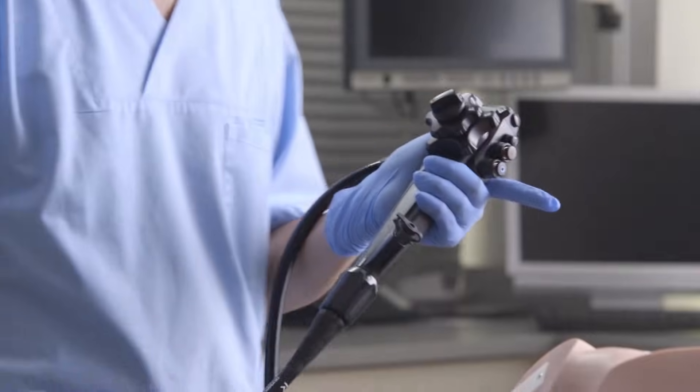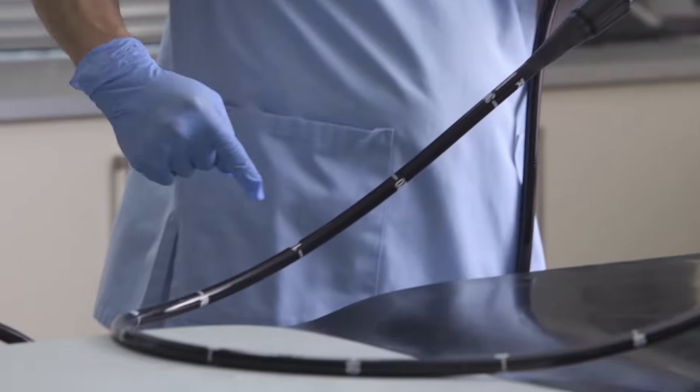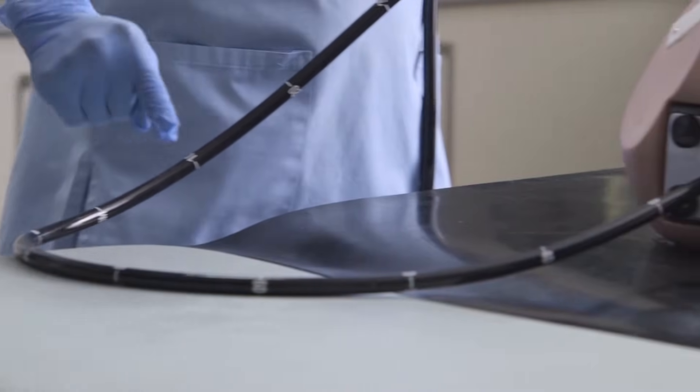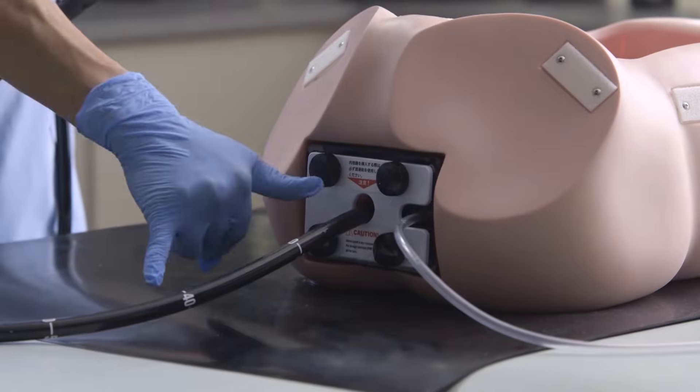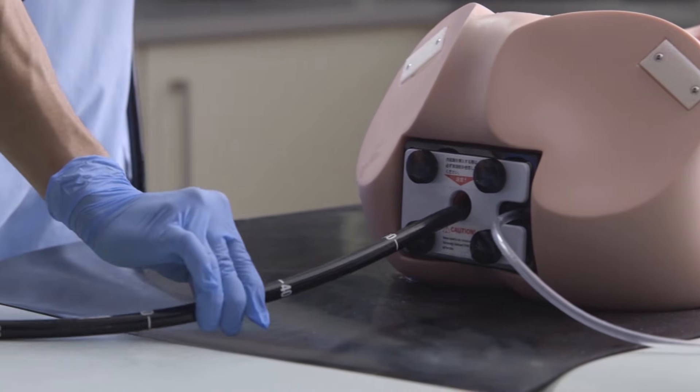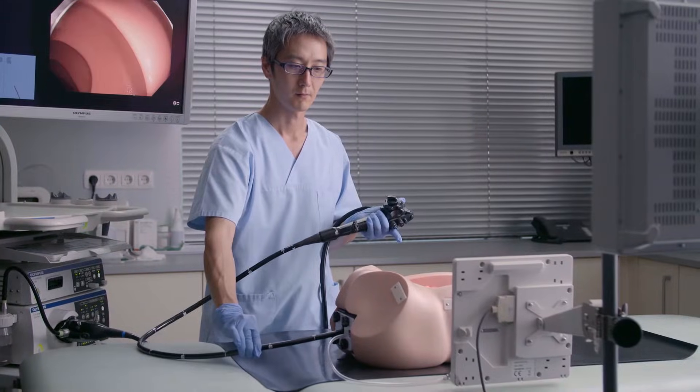Grab the control section firmly with your left hand, placing the insertion tube on the table forming a big loop. Then, hold the insertion tube approximately 30 cm from the anus.